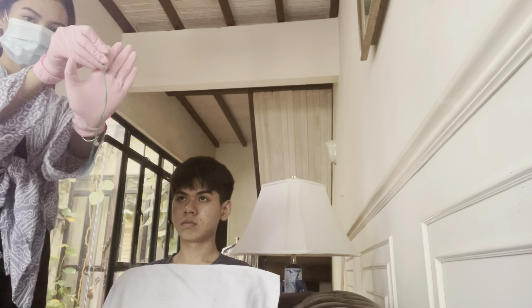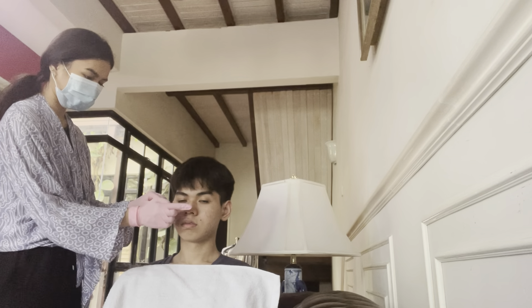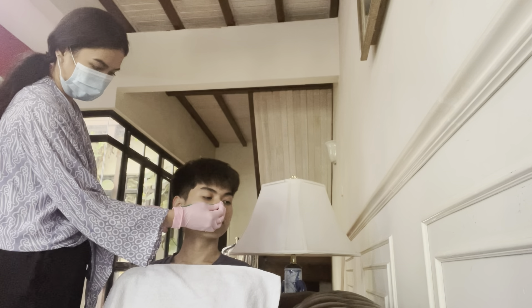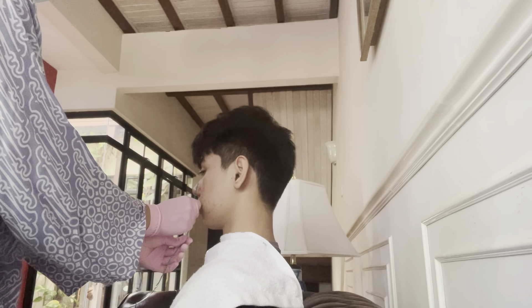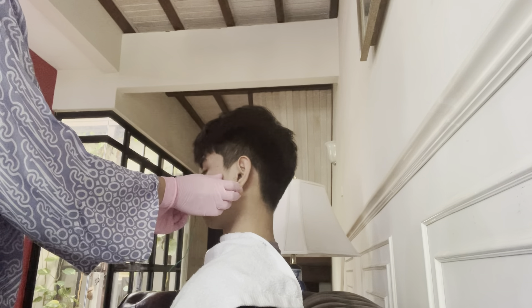I didn't have an esogastric tube, so pretend that it is one. Measure the tube distance from the tip of the nose to the earlobe and then to the xiphoid process. You should mark the length on the tube with tape prior to the insertion and lubricate 7.5 cm of the tube. Insert the tube into the patient's nostril that has the greatest airflow, advancing it along the base of the nasal canal directly horizontal towards the nasopharynx.